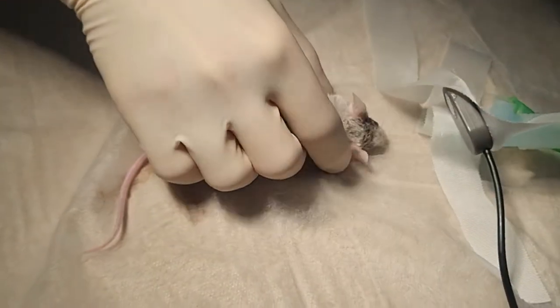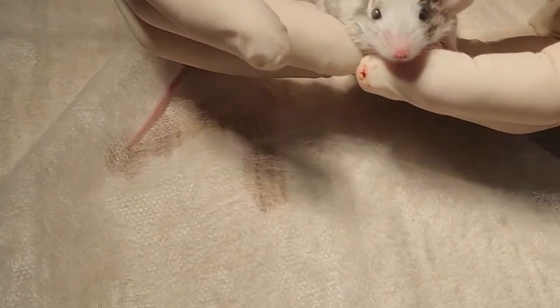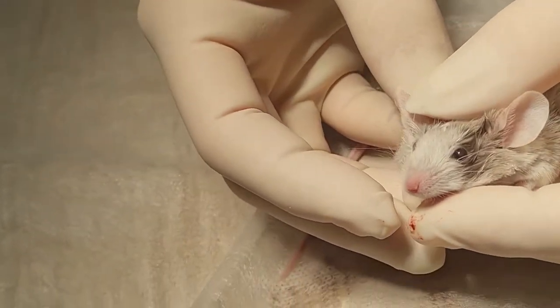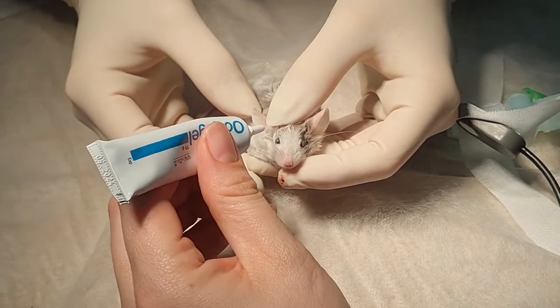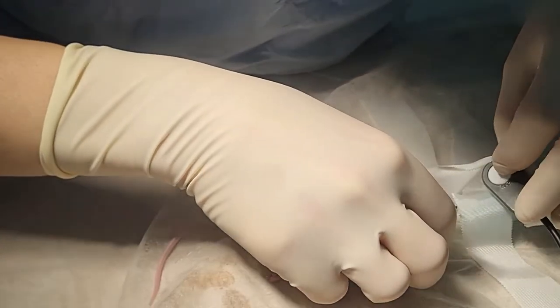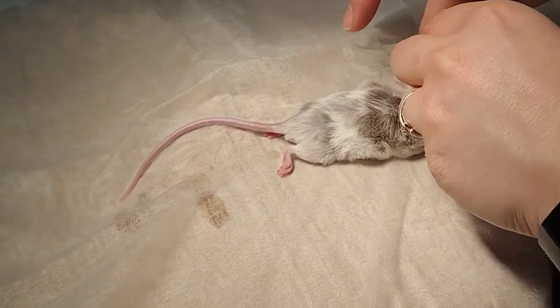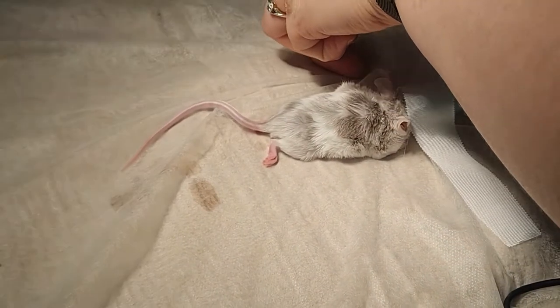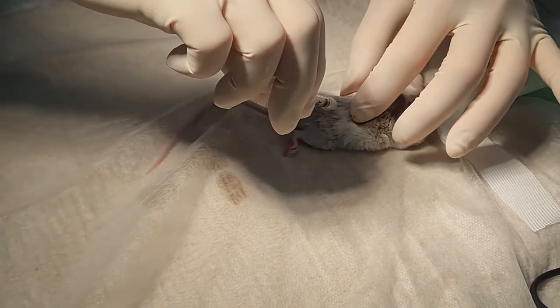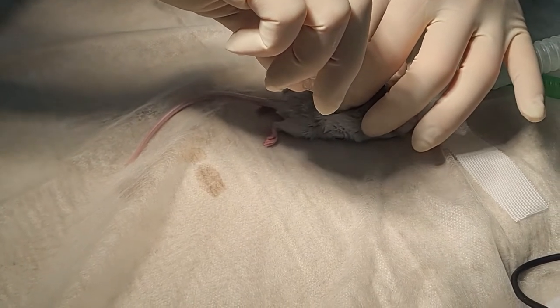Now this little guy is demonstrating quite nicely — particularly his eye — that we do get a lot of alpha-2 related cataracts. Almost always in mice, sometimes in rats. So a little bit of lubrication, and then he's going back into the oxygen for recovery. We generally give the reversal agent — we're using atipamezole intramuscularly. Our IM injections go into the lumbodorsal muscles, which is the one I find easiest for most of our species.